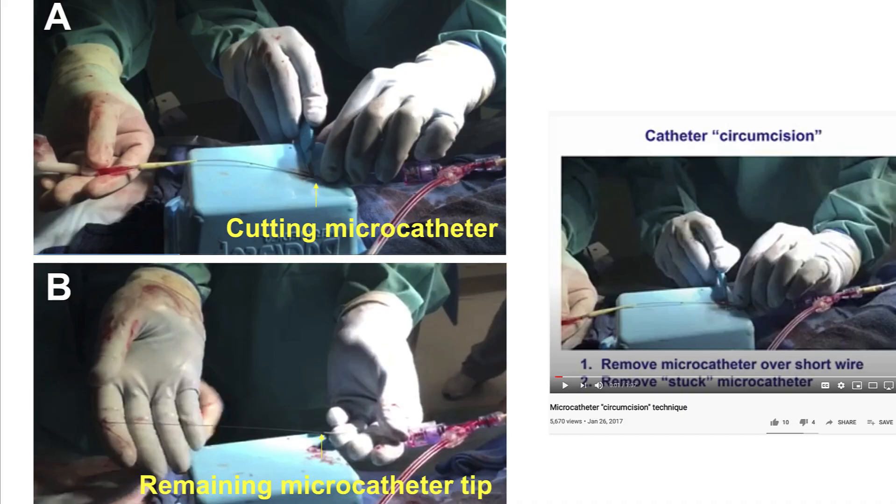The last technique is the circumcision technique — the least commonly used, most often employed when there are issues such as stickiness between the guide wire and the microcatheter. The microcatheter is pulled back as far as possible over the short guide wire, and then a scalpel is used to cut the microcatheter around the guide wire. That piece of the microcatheter is removed, then the microcatheter is moved back and cut again until the entire microcatheter is removed. A specific video on the microcatheter circumcision technique is already uploaded on YouTube.